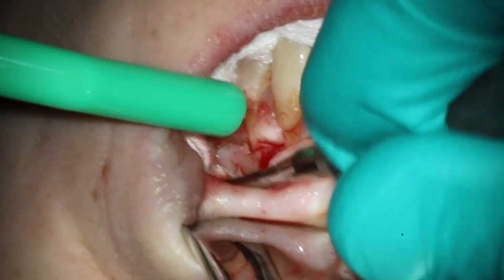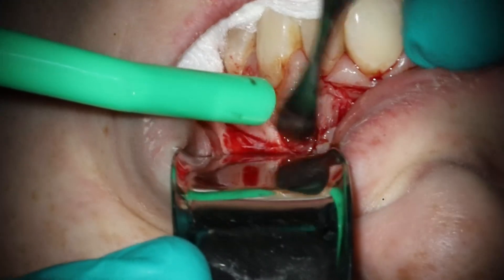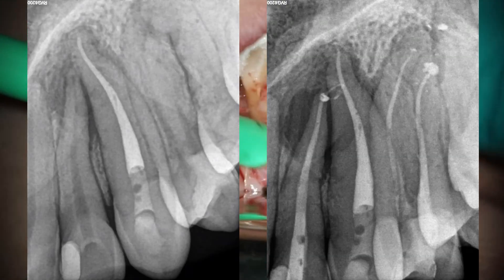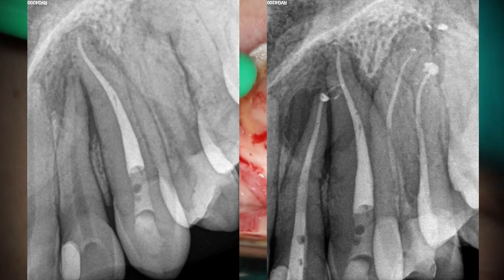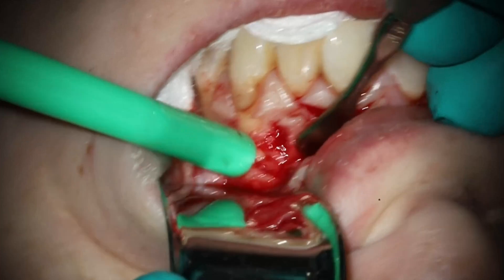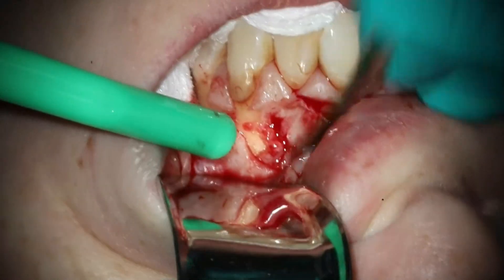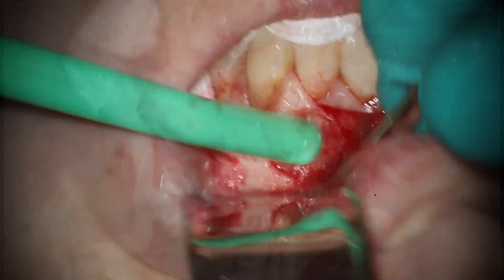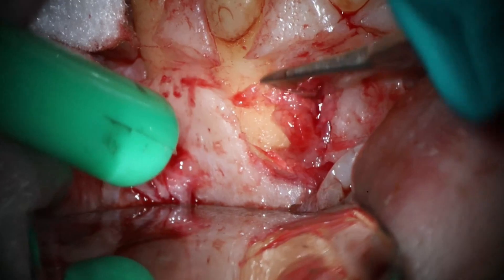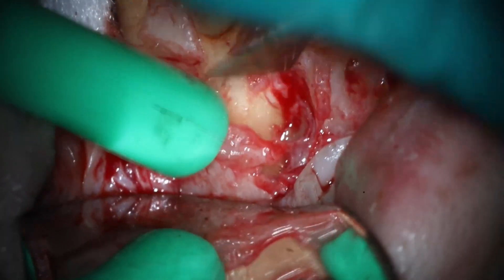Go ahead and keep laying that flap. As you can see, that bone loss — just not feeling too happy about all that. The infection was also up pretty high. Comparing the first and last PAs, you can see it definitely grew over that time even with all the work we were doing. 10 and 12 were dead; they did need root canals. That wasn't the source of it, but just how this all congealed together is what always made me concerned. You can see that loveliness as we start to get inside there and start to remove the cyst — the lesion that's stuck in there.